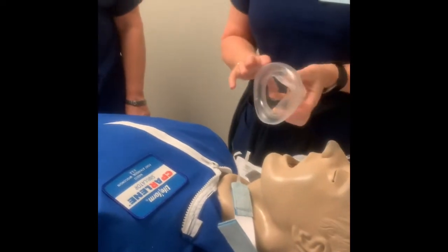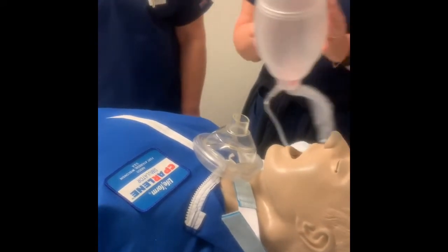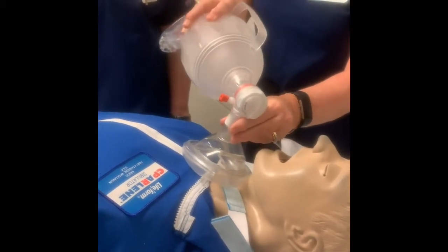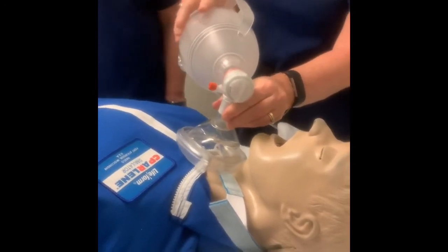Okay, yeah, I just don't quite know. That's a pediatric mask. I don't have one. We have one. And then I would have somebody call about having it reinserted. Okay. And who would you call first, though? Who would I call first before that? I might call SWAT.